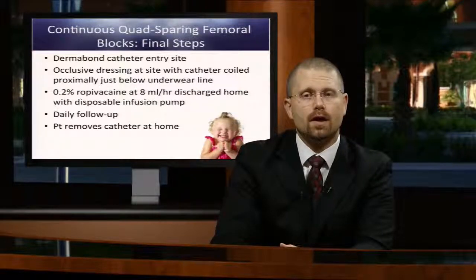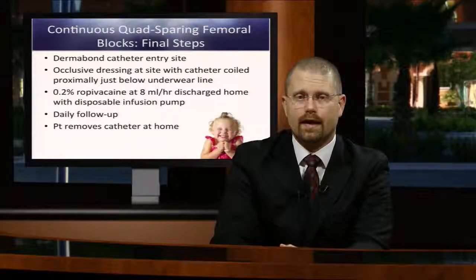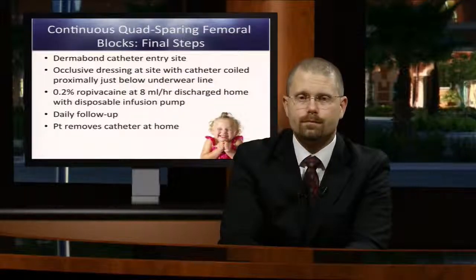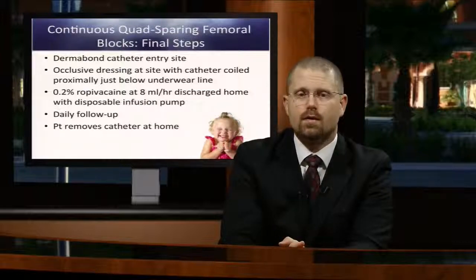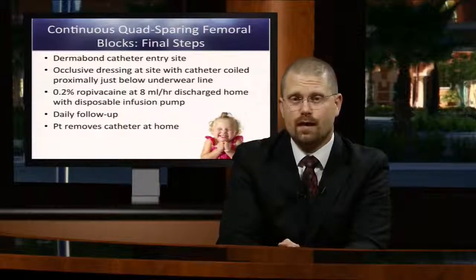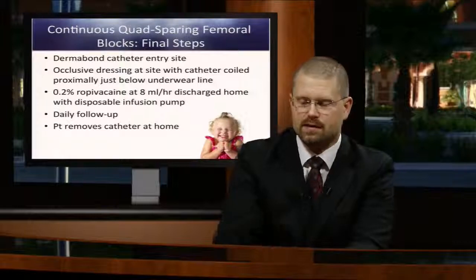Whereas if you have room to go up, you can always try it and tell them if they develop weakness that they can go down. There are issues with this in falling, so you can do this at your own recognizance. 62.5 hours is the duration of a pump running at 8 milliliters an hour with 500 cc's in it. So the patient will remove their catheter at home after 62.5 hours. Our average pain scores for ACLs for the last 62.5 hours have been between a 1 and a 3 out of 10 with high degree of patient satisfaction.